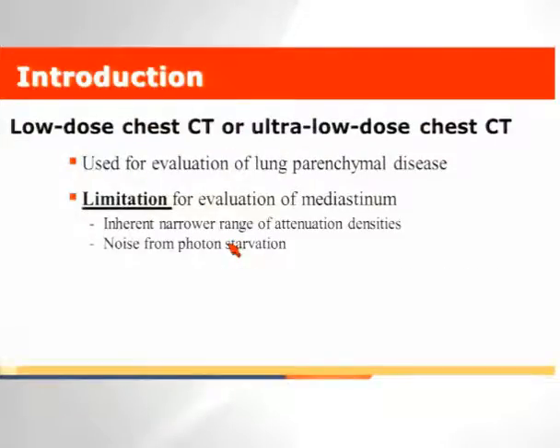Low-dose chest CT or ultra-low-dose chest CT is recently used for evaluation of lung parenchymal disease because of its high intrinsic contrast and low attenuation. However, these have some limitation for evaluation of mediastinum due to inherent narrow range of attenuation densities and noise from photon starvation.